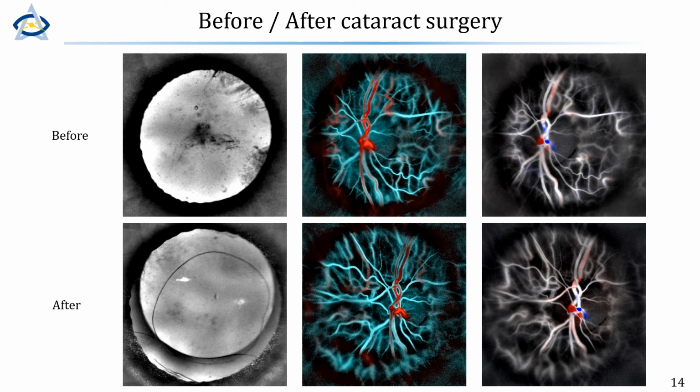There are at least two reasons that we can think of for that. The first one is obviously that we're not imaging small features, which would be the first ones to be affected by cataract. And the second one is that we are using the whole pupil both for the illumination and collection of light from the eye. So if there is something obstructing the light in the center of the pupil, then it's not so dramatic because we're still benefiting from the rest of the pupil area.